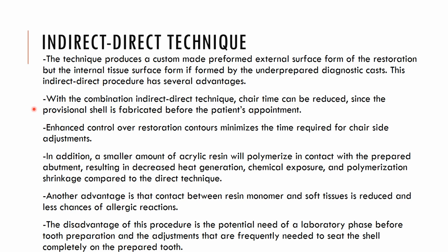Enhanced control over restoration contours minimizes the time required for chairside adjustments, and additionally, a smaller amount of acrylic resin will polymerize in contact with the prepared abutment, resulting in decreased heat generation, chemical exposure and polymerization shrinkage compared to the direct technique. Another advantage is that contact between resin monomer and soft tissues is reduced and there are fewer chances of allergic reactions.